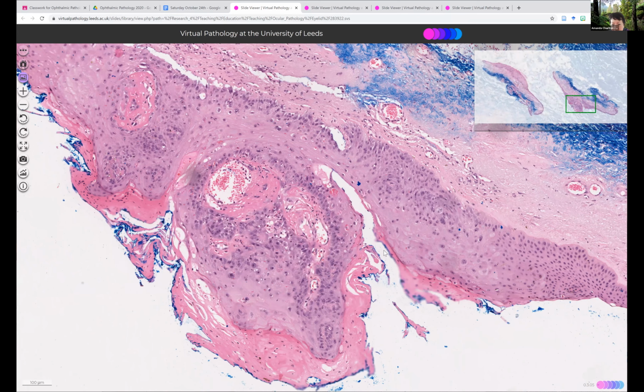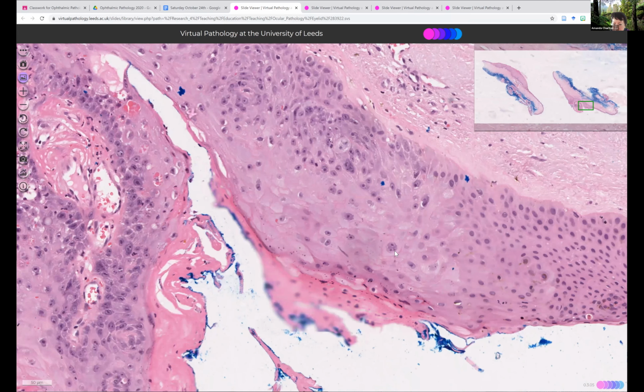Yeah, this is a dysplastic nucleus, and it's in the upper half of this. Yeah. So how do we know it's not just a papilloma or a hyperkeratosis? Yeah, I think that the hyperchromatism, the pleomorphism, and the mitoses above the base are the giveaway.